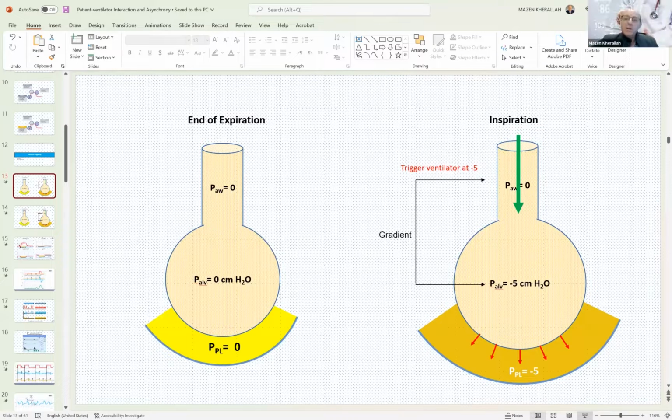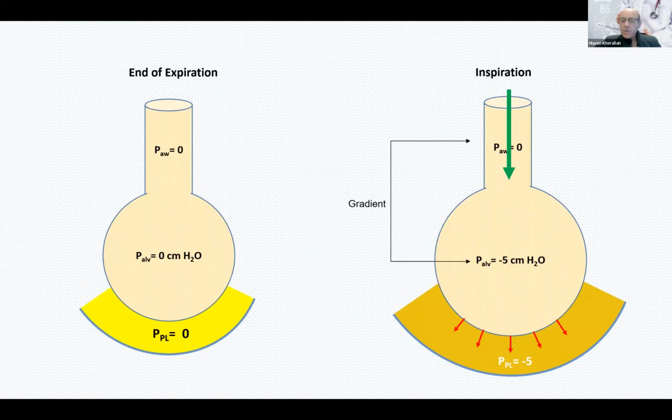Okay, Bismillahirrahmanirrahim. So today we're going to go into details and explain ineffective triggering and what are the clinical situations that we may encounter during mechanical ventilation that will lead to ineffective triggering. And first I want to explain what triggers the ventilator.